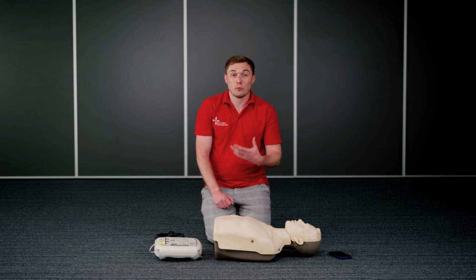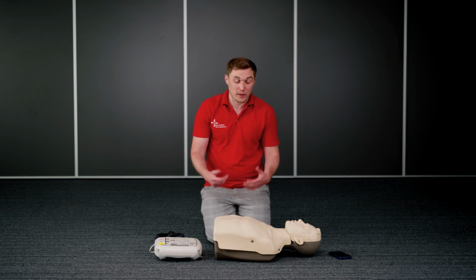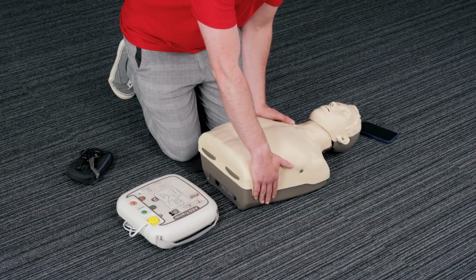These will be indicated of where you are to place them on the pads themselves, so please be reassured if you ever forget where they go. First one is going to go top right of the chest. Second one, lower left, just on the side of the rib cage.